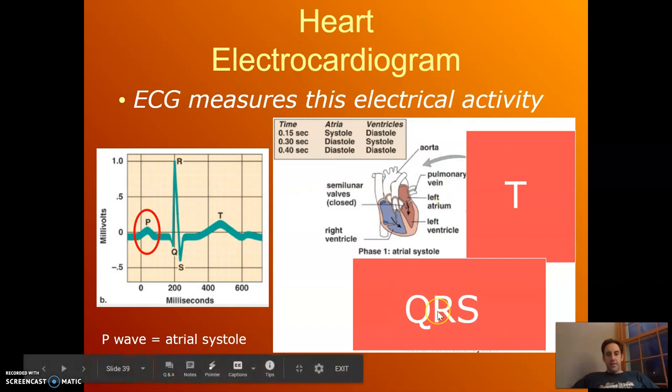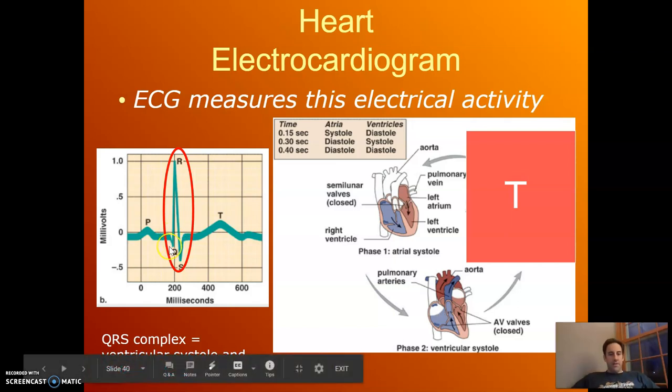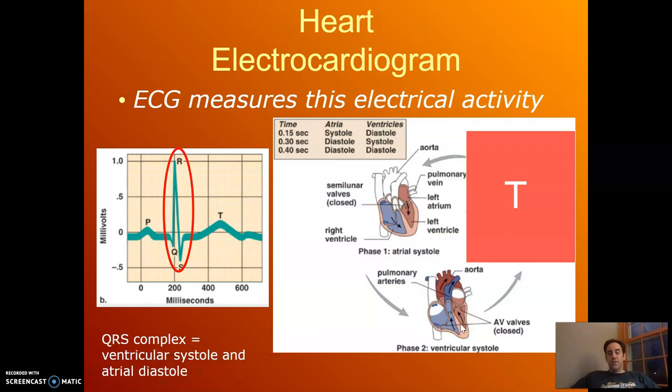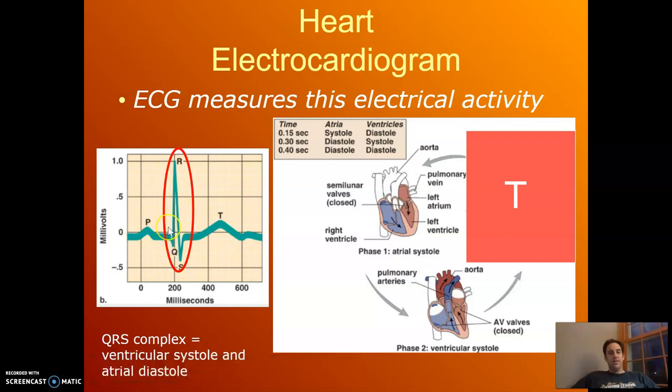The QRS complex is where the ventricles contract. And that's this larger peak. And you may wonder, well, why is this so much larger a peak than that P wave? And there's two reasons for that. One reason is that the QRS complex represents the contraction of the ventricles, and the ventricles are thicker. There's more muscle, which means there's more electrical activity, which means it's a bigger peak. The other reason is the atria are in diastole at this point as well. And so part of this big peak is the ventricles contracting. Another part of the peak is the atria essentially resetting themselves so that they can fire new action potentials.